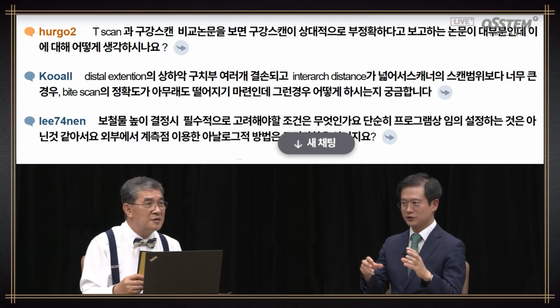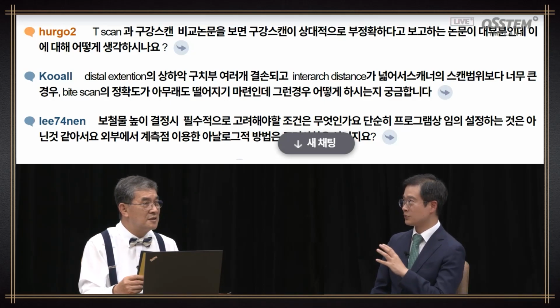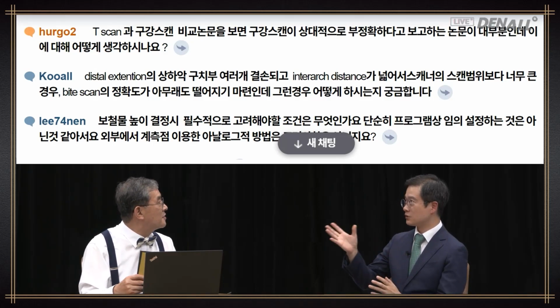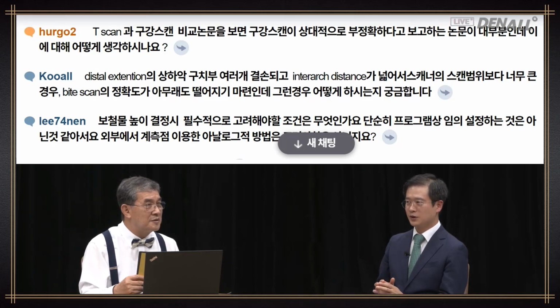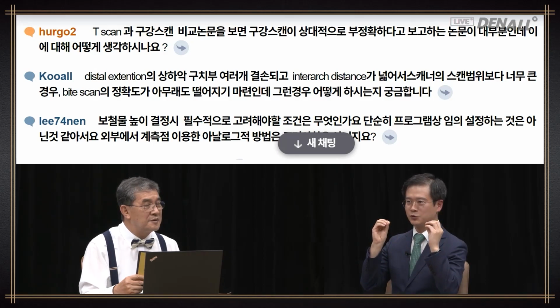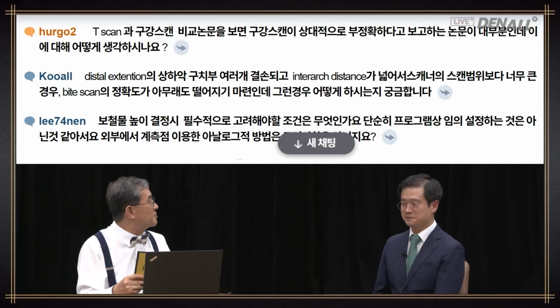Oral scan needs to be taken very accurately. That's my belief. Distortion free is important, and the lateral bite scan needs to be taken properly. You may think it's all very difficult, but if you can do the scanning properly and simply from the occlusal table, I always see a lot of CO stops. So this is a very good bite. That's the kind of scan that I get. I think ability to do oral scanning is more important.